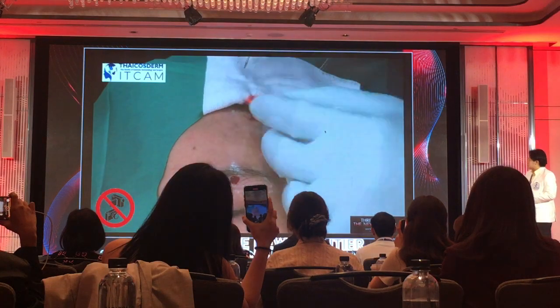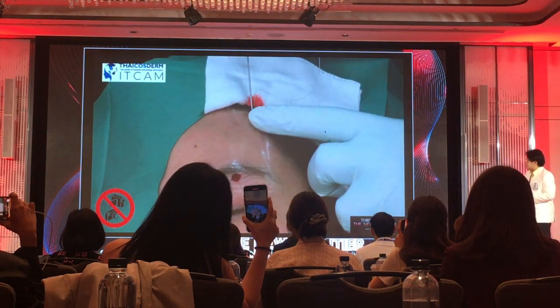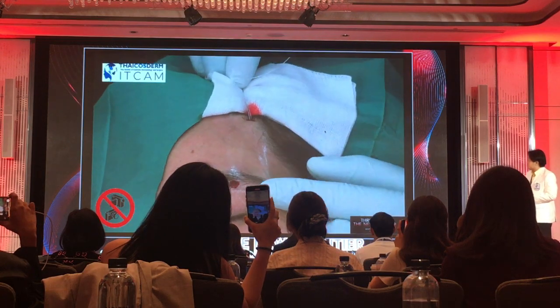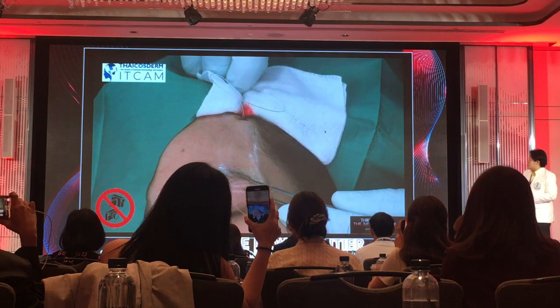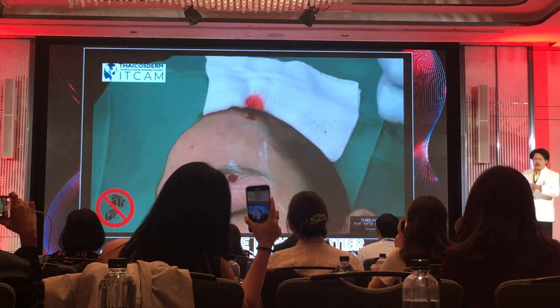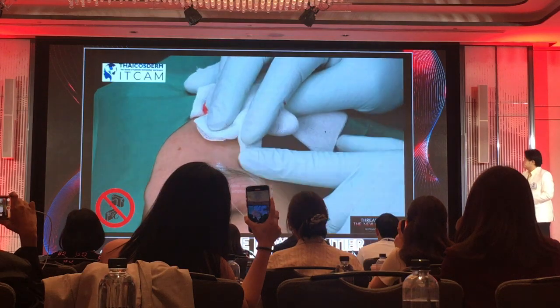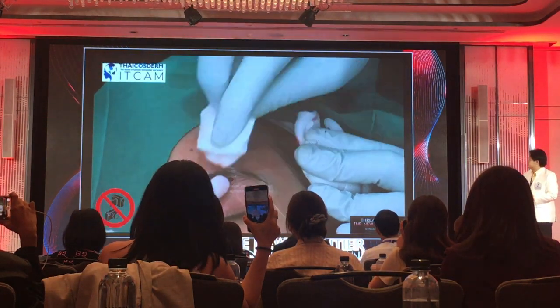The one arm is already inside. The second arm is also inserted into the deep plane, going to the tail of the eyebrow. You will see that I pass the superciliary arch very easily because I pinch the skin up. And the whole thread is in the plane.